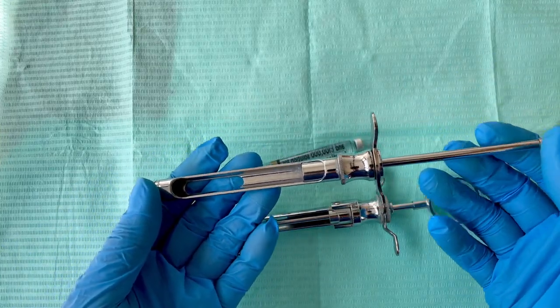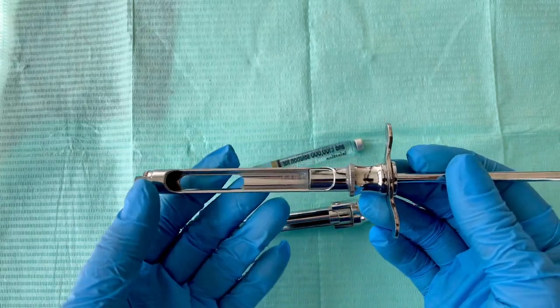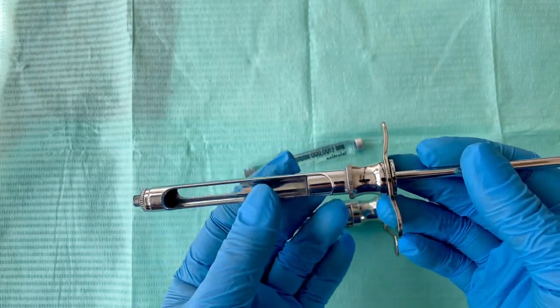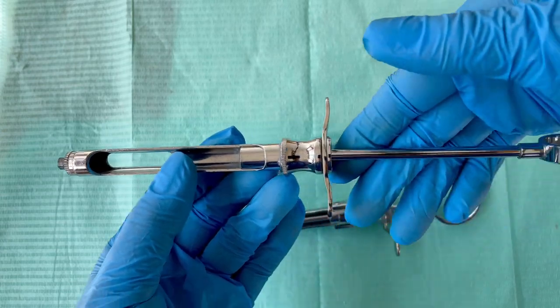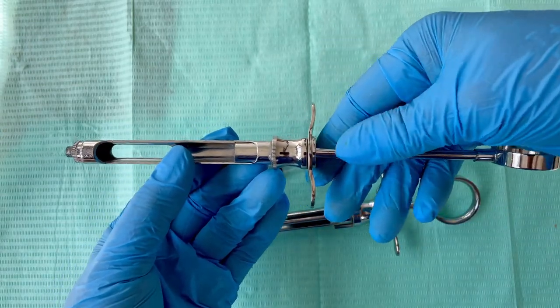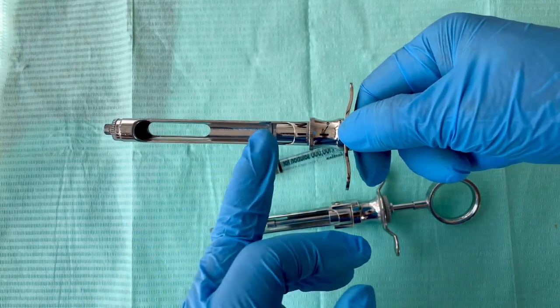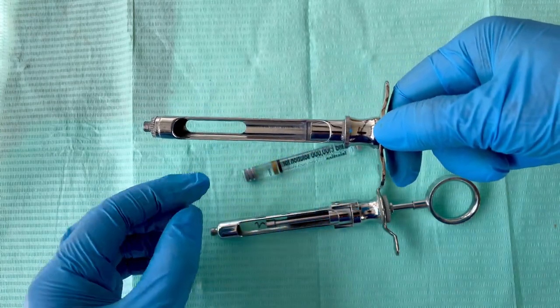Now this is the side loading dental syringe. To load the cartridge in this syringe, you cannot bend the syringe — all you need to do is pull the handle. Hold the handle, put your thumb there, and pull it. You can see this metal here is moving.